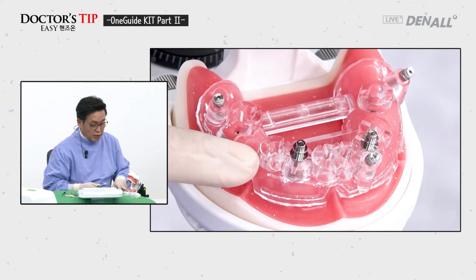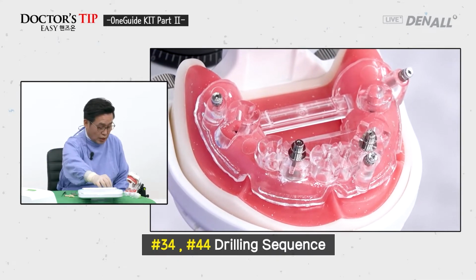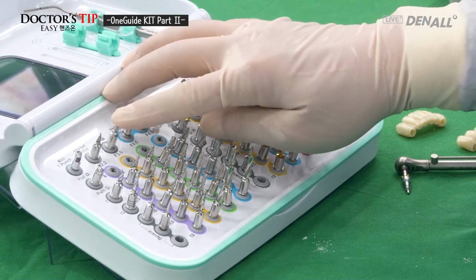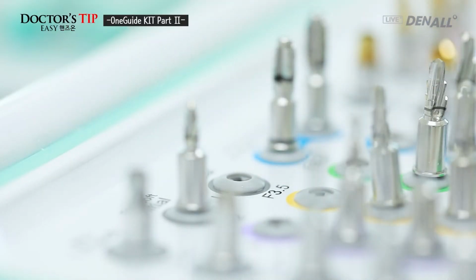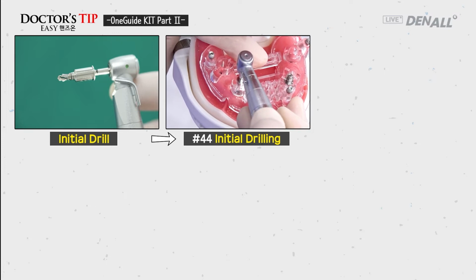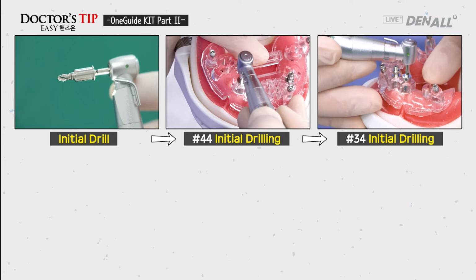At this stage, on number 44 and 34, 4.5 by 10 millimeter implant is going to be placed, and the 3.5 initial drill is chosen again, 5.1 hole regular size. On number 44, initial drill is done. Up and down. On number 34, initial drill is being done.